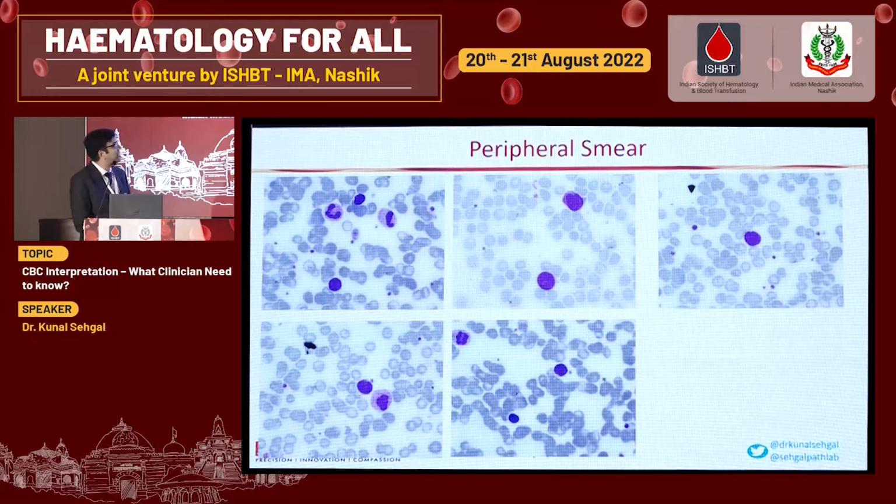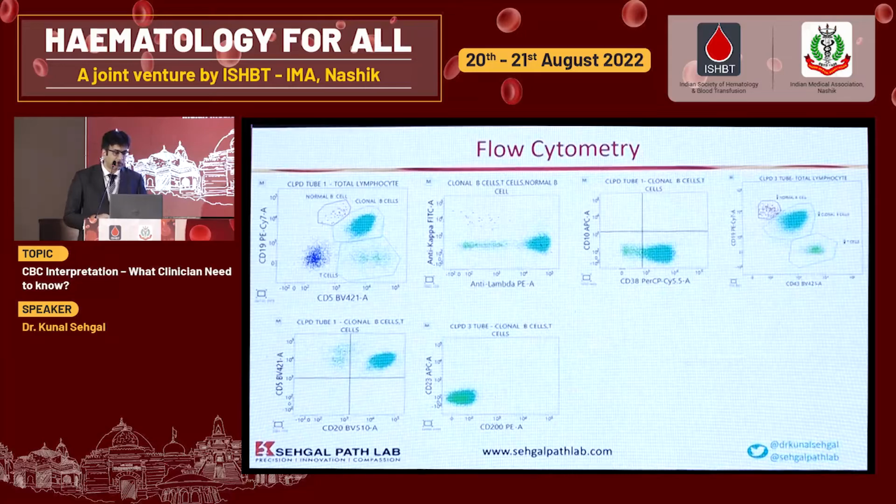We saw the smear referred to us. Nothing very, very unusual, but some of the cells have subtle clefts, subtle lymphocytes. But frankly, if you show me this morphology without the CBC report and the count, I might let it go as almost normal reactive lymphocytes. Very closely, some of the cells have clefts, so you are suspicious.